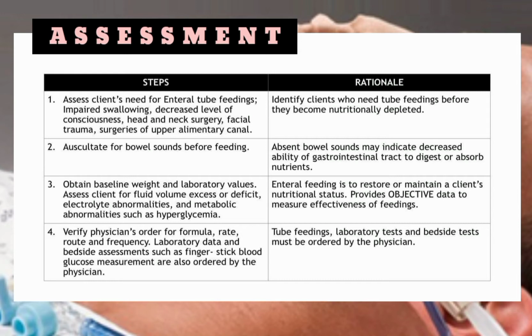Enteral feeding is to restore or maintain clients' nutritional status, and provides objective data to measure effectiveness of feeding. Verify physician's order for formula, rate, route, and frequency. Laboratory data and bedside assessments such as finger stick blood glucose measurement are also ordered by the physician. Tube feedings, laboratory tests, and bedside tests must be ordered by the physician.